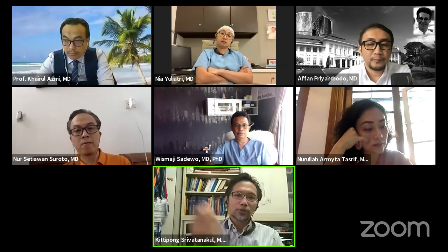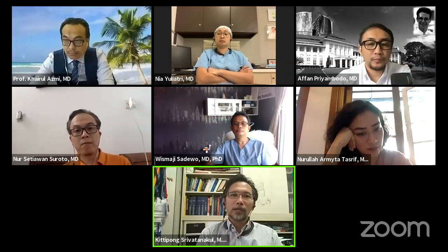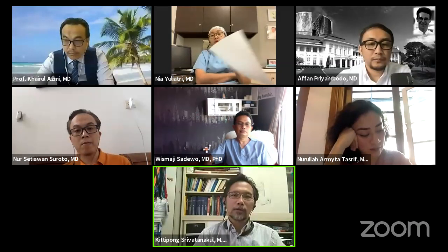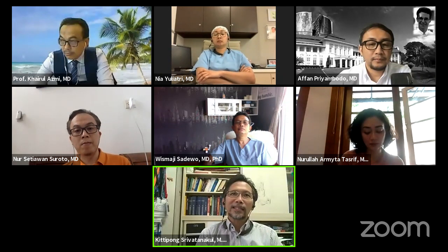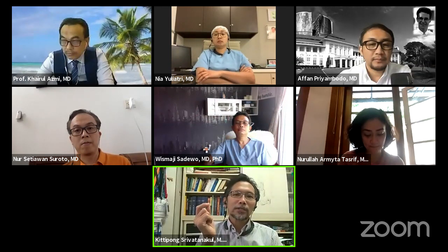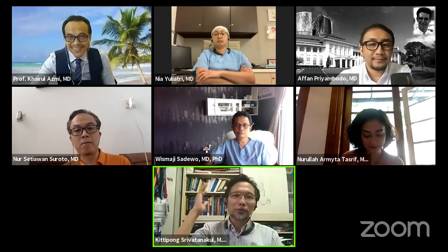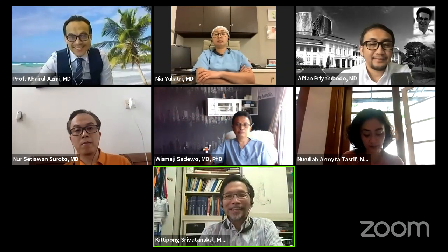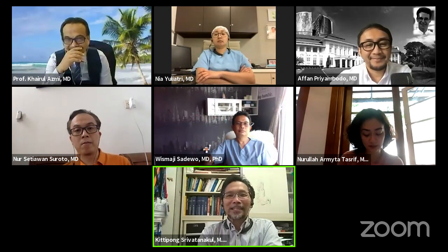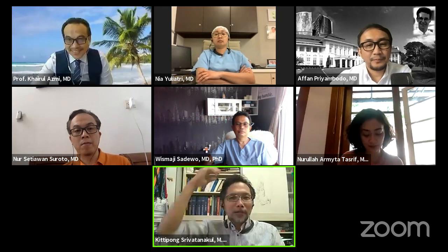We need a balloon to control the catheter, and I would not be too aggressive in embolizing, trying to penetrate everything. But to be honest, if you have a leak of glue or something, one drop in the ICA, it depends on where it goes. Usually it's not a big disaster, but we don't intentionally let anything go over there.